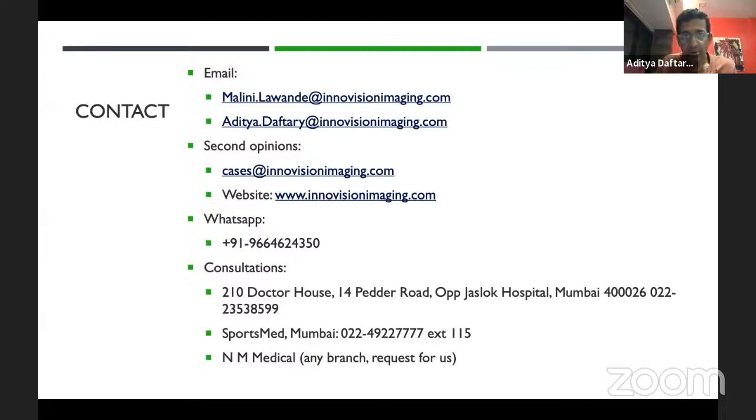I'm going to just take off on this session. I think I mentioned there are three things we're going to try to look at in this session. One is the patellofemoral compartment. Two is going to be the articular cartilage, and three is going to be looking at the synovium and joint effusions and synovial bodies. I think that will give us a relatively decent overview of most of the things that we look at with knee MRI. And what we'd want to leave for the last session is something where we can create some sort of a collective of the doubts that people have, and maybe build something out from there.